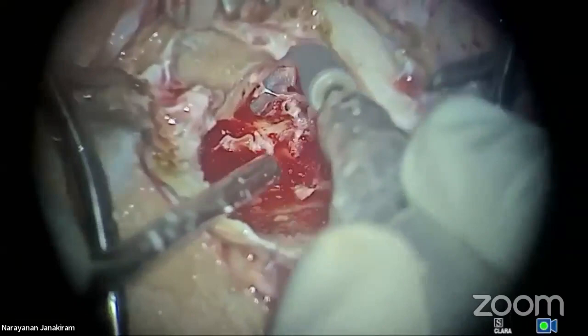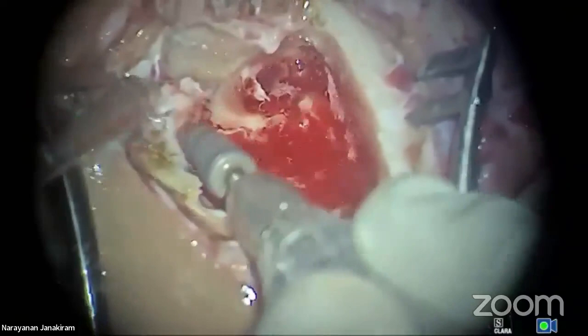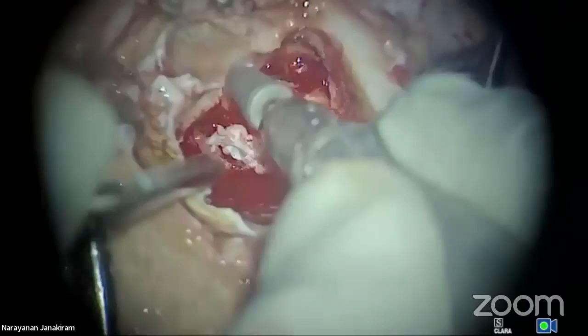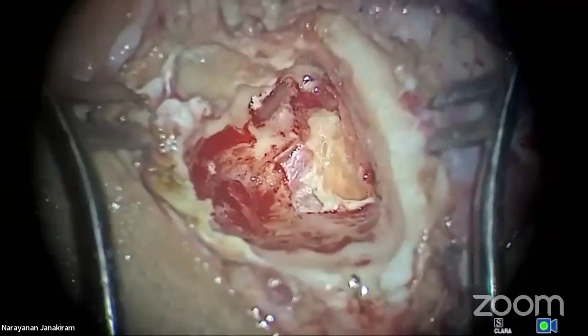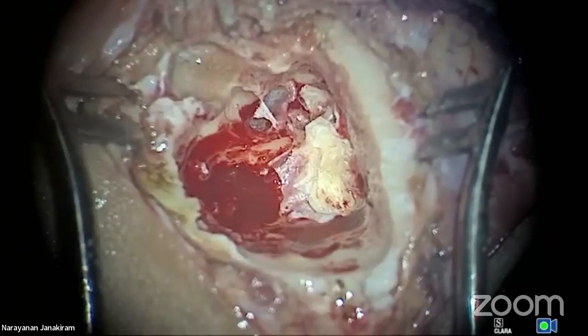Now I think I've done everything with a single burr. I didn't change my burr at all. Did you see that? Now I'm just going to take right to the tip because the cholesteatoma is going towards the tip. Can you see here? Now always try to drill the tympanic plate. I've told you hundreds of times. Now I'm going for the diamond burr. So now only I'm changing to the diamond burr. Can you see, my dear friends, all of you? So how many minutes did I drill? Around 7 minutes exactly. And I finished the MRM.